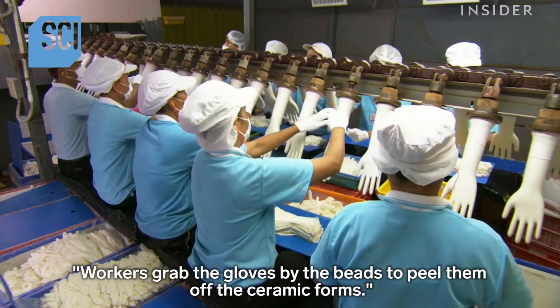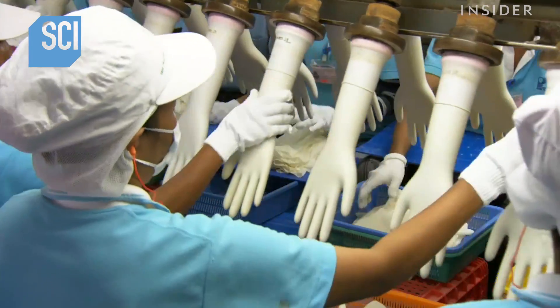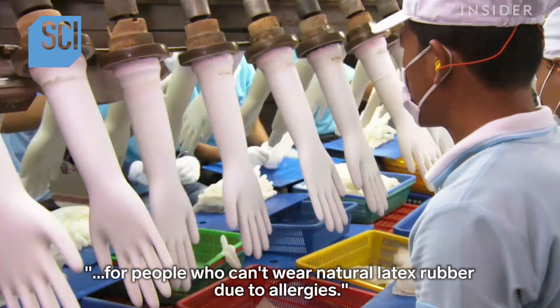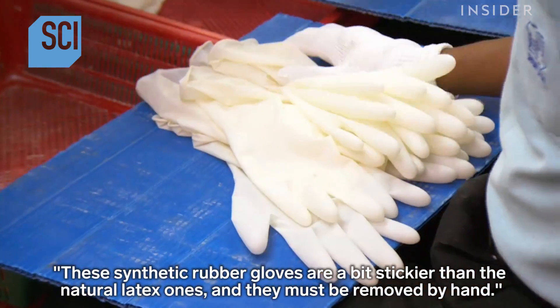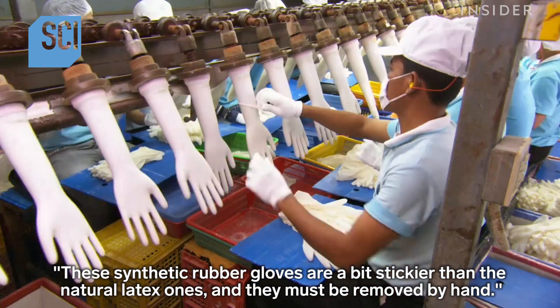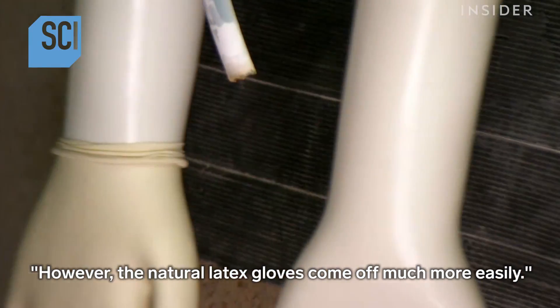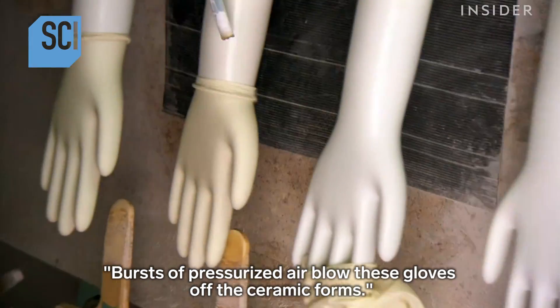Workers grab the gloves by the beads to peel them off the ceramic forms. These particular medical gloves were molded from synthetic rubber for people who can't wear natural latex due to allergies. Synthetic rubber gloves are a bit stickier than natural latex ones and must be removed by hand. However, natural latex gloves come off much more easily — bursts of pressurized air blow them off the ceramic forms.